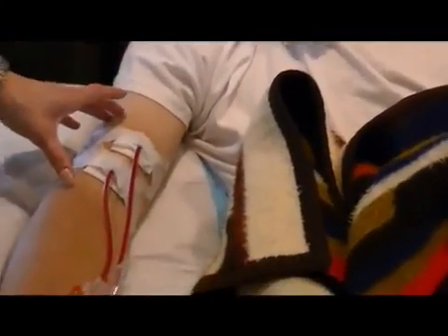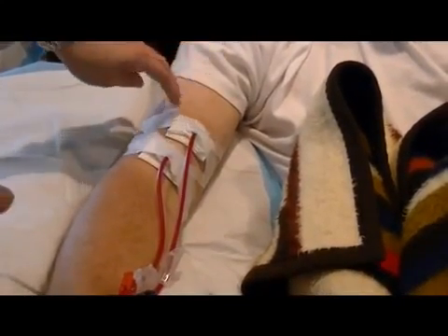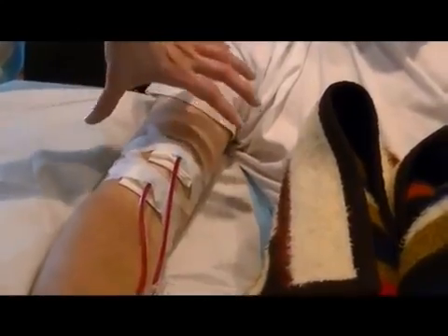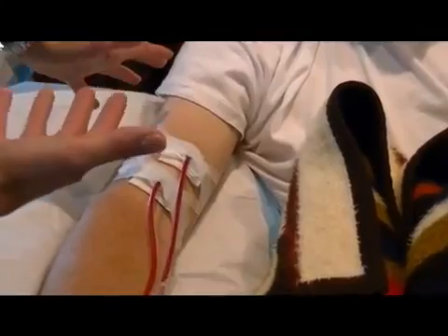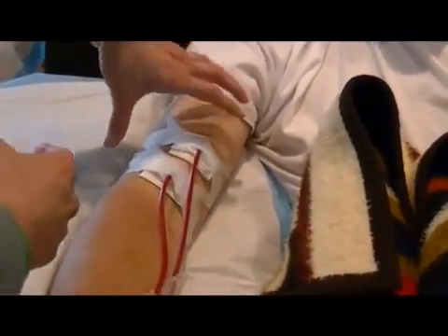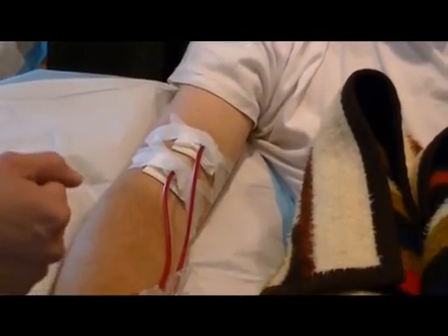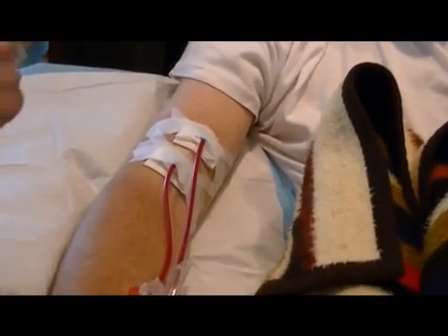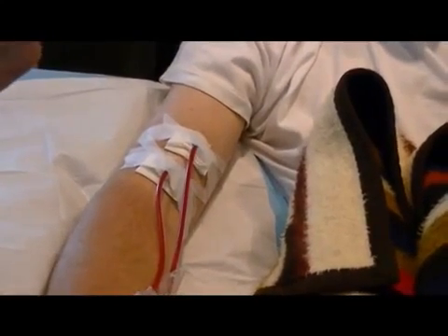So he has his fistula, and the reason that you watch your pressures and keep checking it is because if he infiltrates, all the blood will be pumping into his arm, and we run at 500 milliliters per minute, so that just starts pumping into that space. His arm gets huge and it turns into a really bad bruise. We've actually done this, and you have to ice and heat off and on for like 24 hours, and it's just a pain and it hurts him.